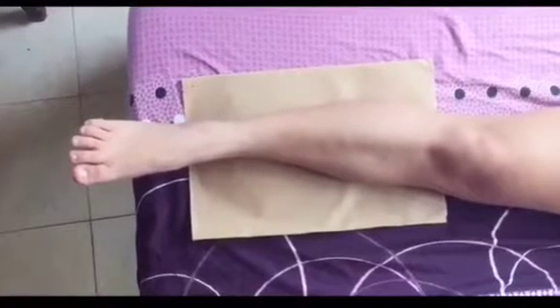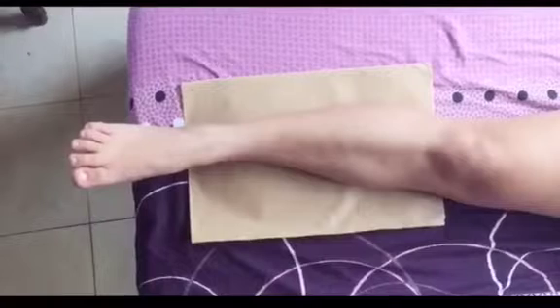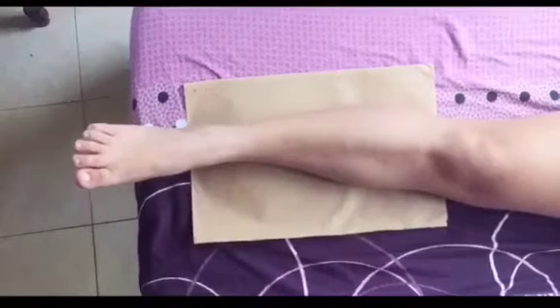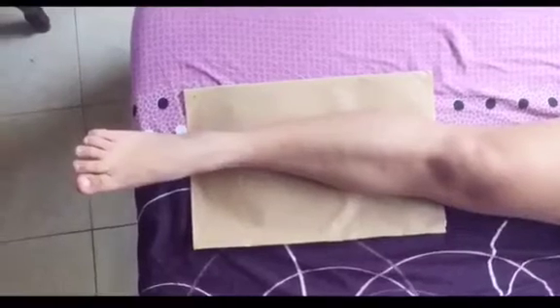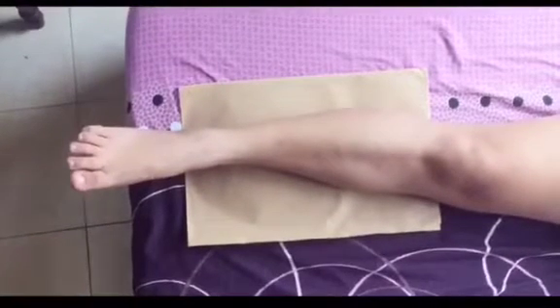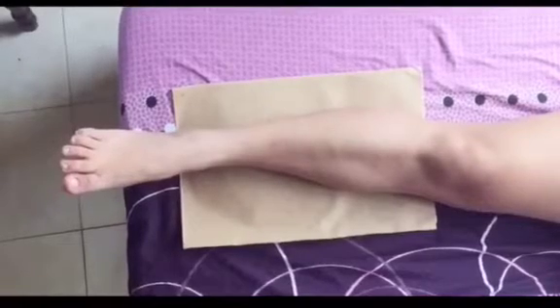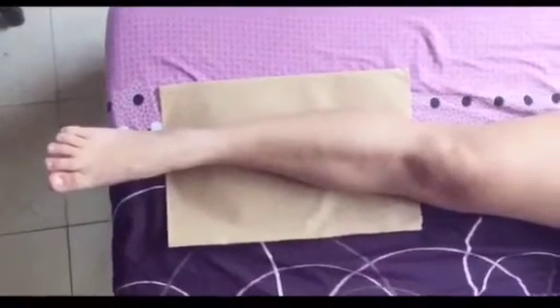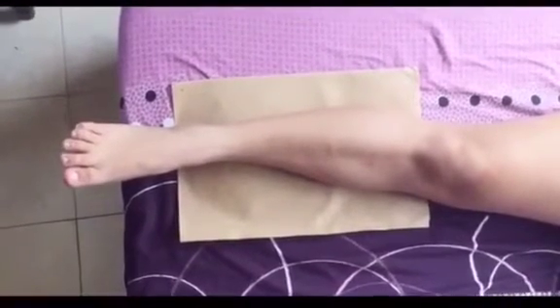For this projection, as well as the lateral and oblique projections described in the following sections, the long axis of the IR is placed parallel with the long axis of the leg and centered to the midshaft. Unless the leg is unusually long, the IR will extend beyond the knee and the ankle joints enough to prevent their being projected off the IR by the divergency of the X-ray beam.